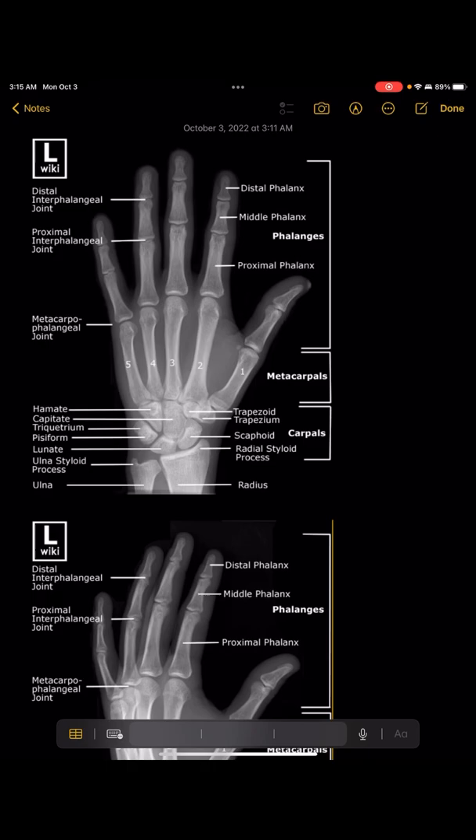When you do a hand X-ray, the normal views that you do are a PA, an oblique, and a lateral. This video is going to be talking about what X-ray techs are always looking for.